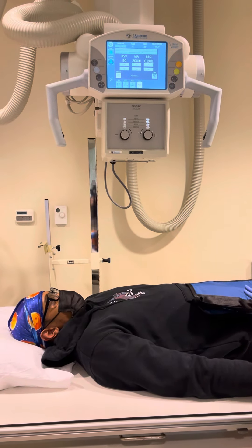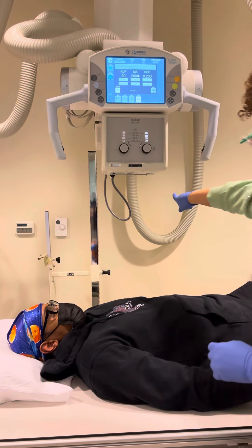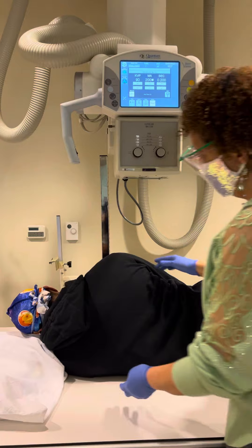I'm getting ready to do my lateral T-spine. For this, I'm going to ask the patient to roll up onto their left side, or roll away from me and point to that wall there. Bring your arms up like you're sleeping, up by your head.